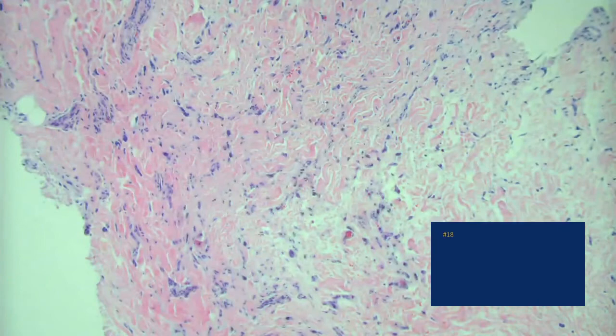Yeah, exactly. So it's a dermal-based process. And you've got these sort of small, bluish, spindle-shaped cells here. Okay, so we need to go to higher magnification to really get a better sense for what this is. Okay, now what do you think? So, kind of lining up. So when I see cells that line up like that, I think of some kind of met.